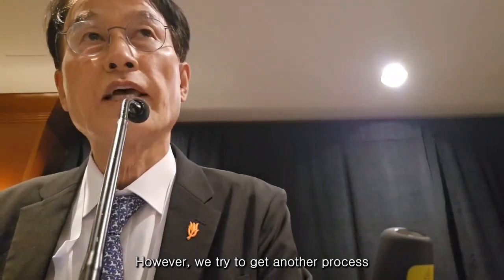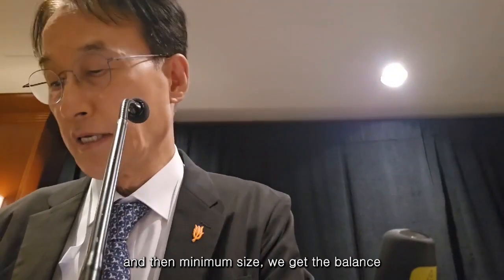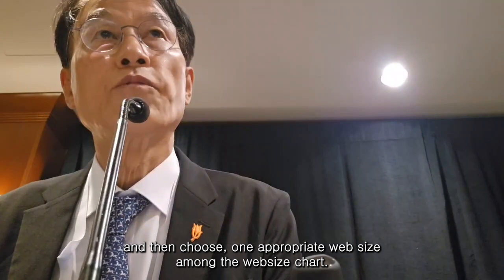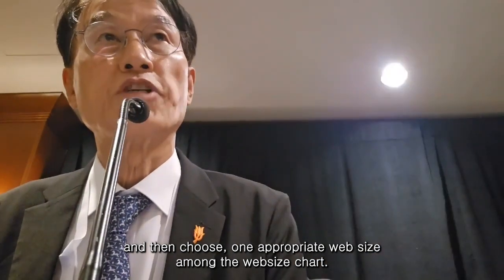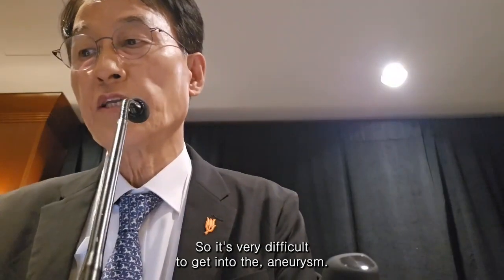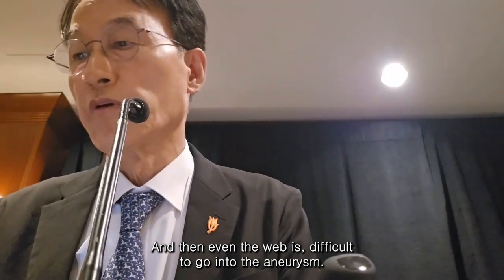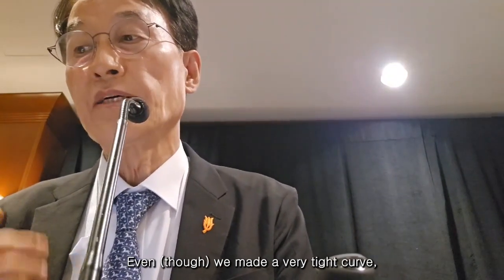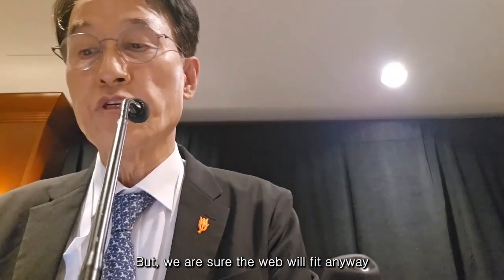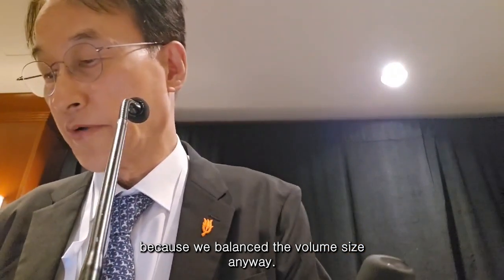However, we try another process to compare the maximum volume size and the minimum size. We get the balance and then choose one appropriate web size from the web size chart. This aneurysm had a very tight A1, so it was very difficult to get into the aneurysm, and even the web was difficult to go into the aneurysm. Even when we made a very tight curve, it came out of the aneurysm. But we were sure the web would fit anyway because we balanced the volume size.